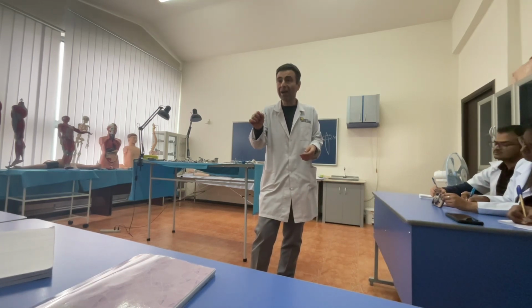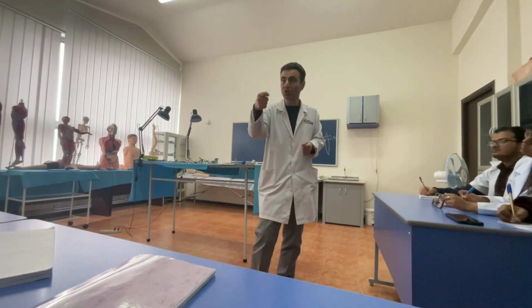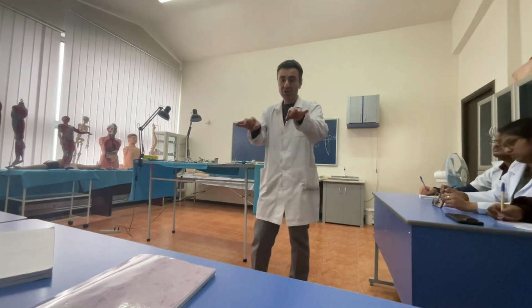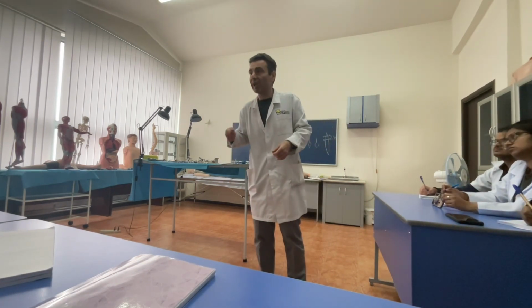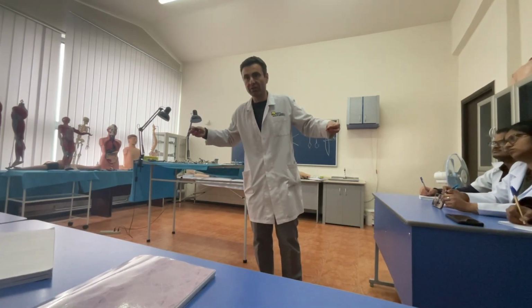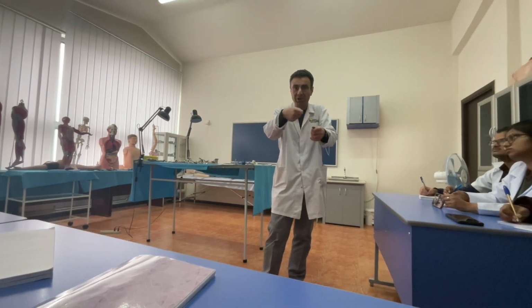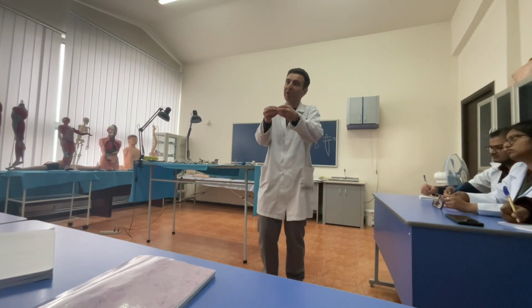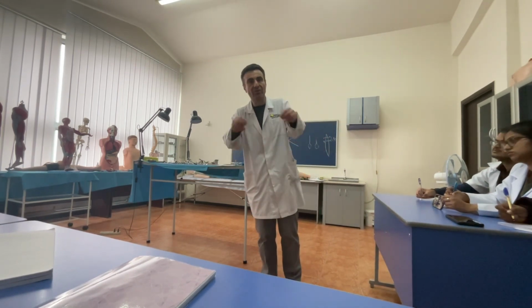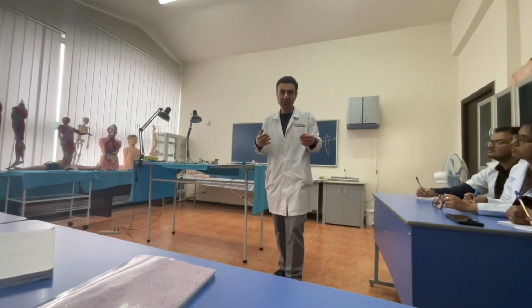Especially if you ligate arteries, because of the high pressure inside of them, if you do not suture and just only ligate it, the ligature can slip off the wall of the artery. And suturing means closing of defects of the vascular wall, recanalization of the vessels. Especially for magistral vessels, which are forbidden to be closed, we must close the defect, or we must make prosthesis of the vessels, or we must make reconstruction of the vessel, for example, bypass. Do you understand? This is the method inside.